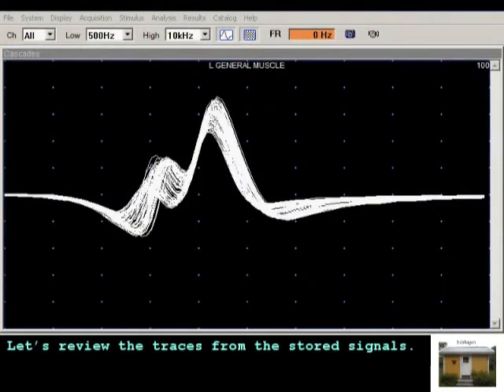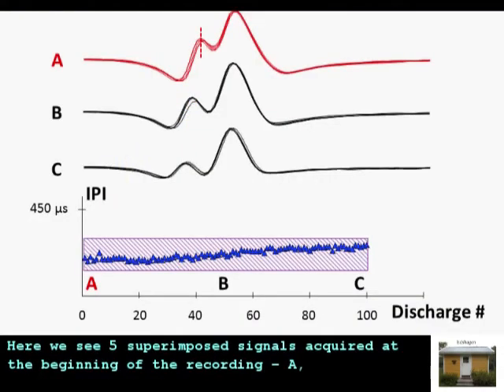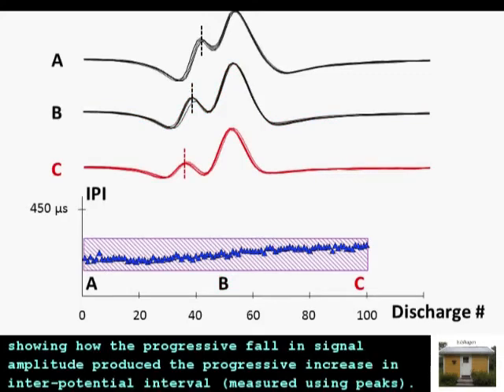Let's review the traces from the stored signals. All 100 sweeps are shown superimposed here. Here we see 5 superimposed signals acquired at the beginning of the recording, A. Halfway through the recording, B. And at the end of the recording, C. Showing how the progressive fall in signal amplitude produced the progressive increase in interpotential interval.